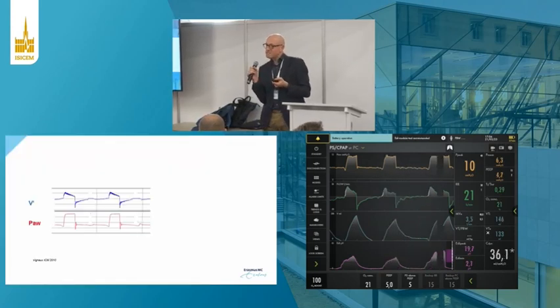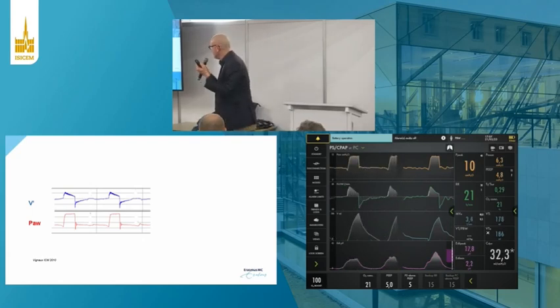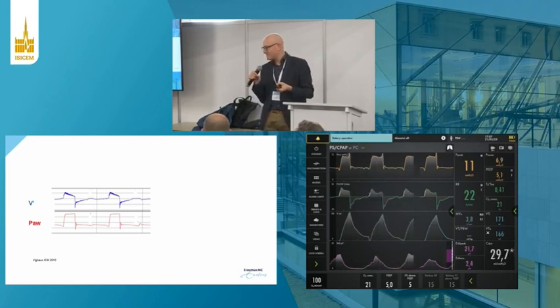So what is this? Right here you can see flow and airway pressure. Anyone else? Wasted effort. So why is this a wasted effort?